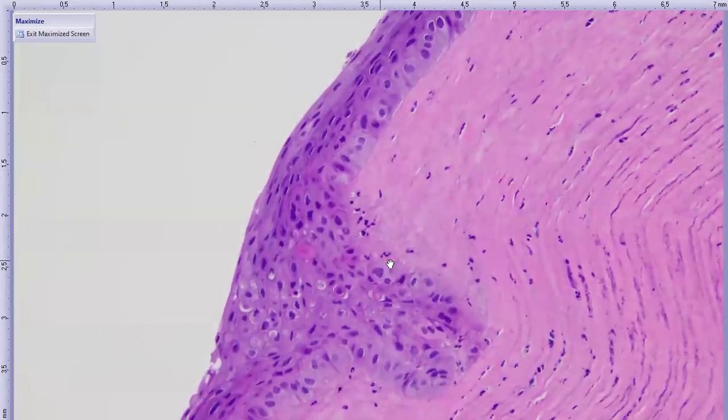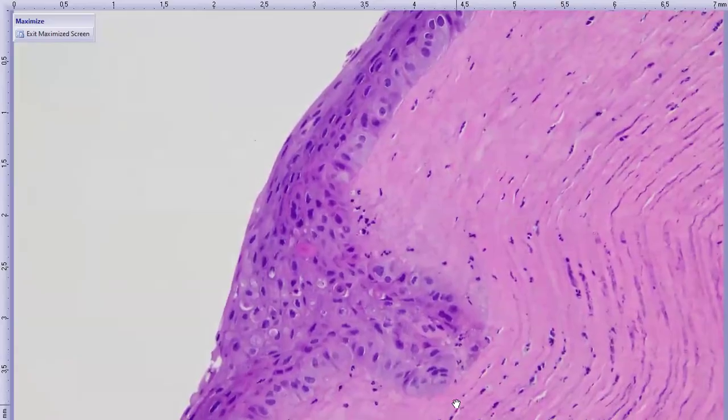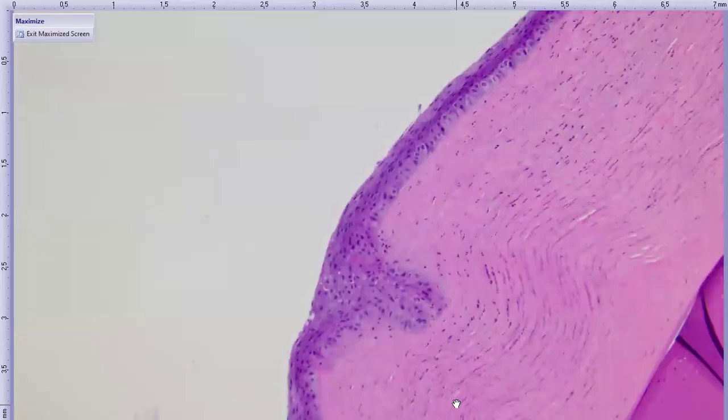So we kind of talked about this site. This almost looks like collagenolysis. And so we wondered, could this have been the point of contact with the bungee toy, which is kind of speculative, but kind of an interesting finding, especially given that the rest of the cornea is somewhat unremarkable.